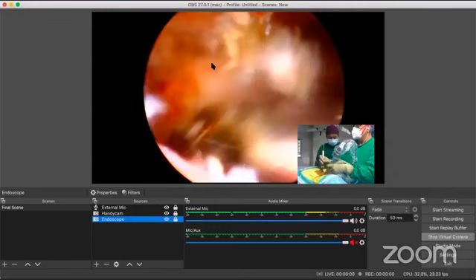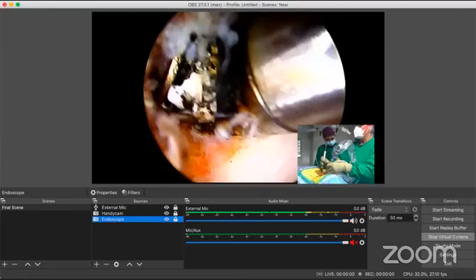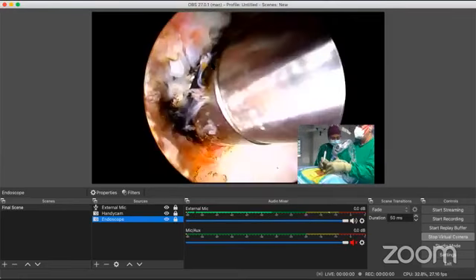Stop please. Okay, can the C-arm machine come in now? I think I've come to the spinolaminar junction that I want to be on.